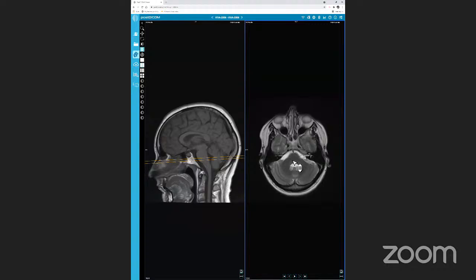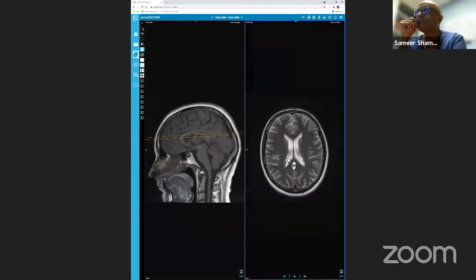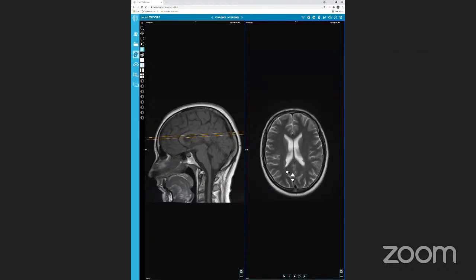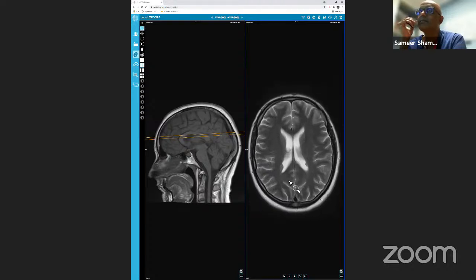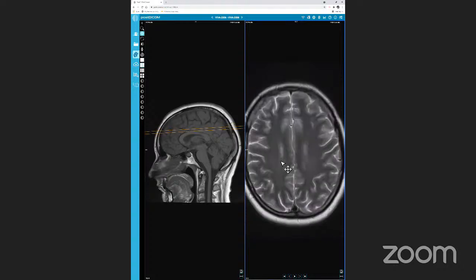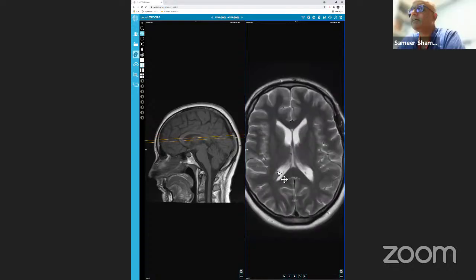I'm not too sure where I cut out, but I was saying there are some intraventricular lesions. Yeah. Particularly within the ventricle, in a patient with epilepsy, the concern is tuberous sclerosis. Do you think it is an intraventricular nodule? What's the signal intensity? Does it look like normal brain tissue, or is it like a proper nodule with calcification? So the patient on the study looked quite old, because we've got normal myelination and normal basal structure. So in a patient of that age, you can think that these are calcified and you have signal dropout. But we've not got that here. The lesions themselves are quite isointense, and there's no signal dropout. Looks more like gray matter, isn't it?